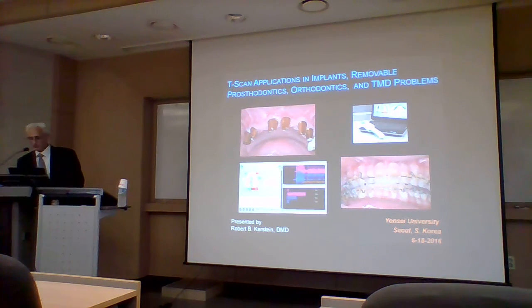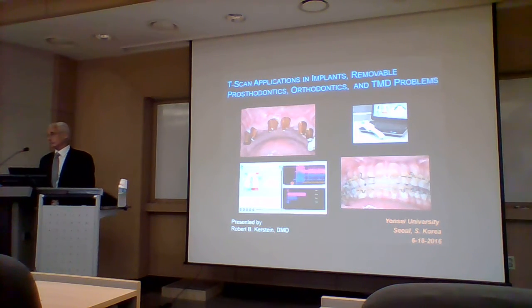So we have a very unique combination of things, the T-scan and the EMG, which I'm going to demonstrate a little later on today. They work together to analyze occlusal problems in the natural teeth. And of course, the T-scan is a great aid in implants and a great aid in case finishing orthodontics. T-scan은 교정 치료 후에 교합 교정할 때 쓸 수 있을 거고, 지난번하고 달라진 건 EMG하고 프로그램상에서 같이 싱크로되면서 나타날 수 있다는 게 큰 차이점일 것 같아요.